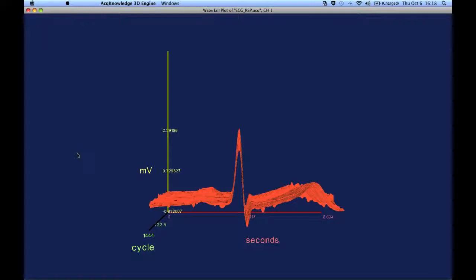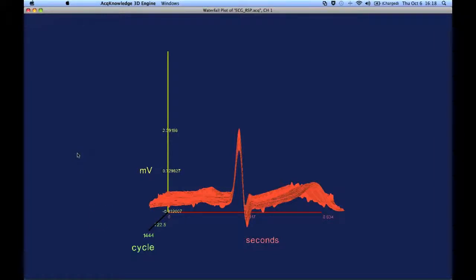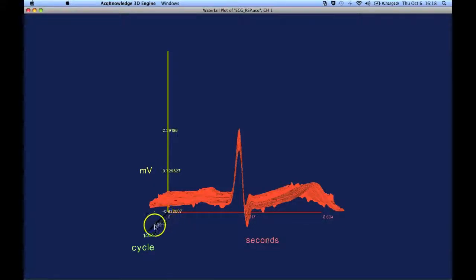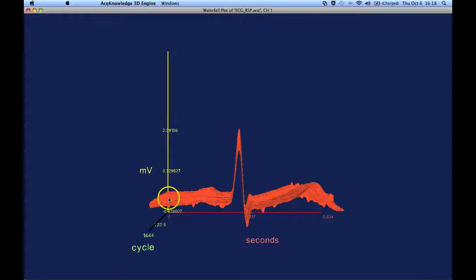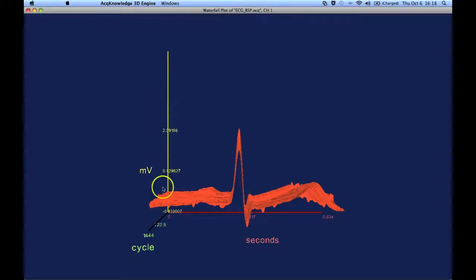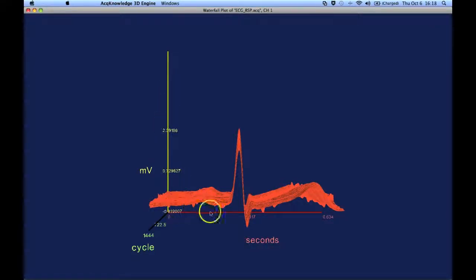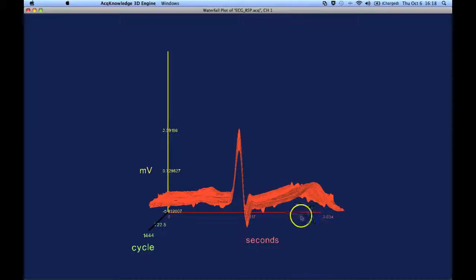This is a 3D representation, and you can see the cycle numbers coming forwards, it's 1,444, got the amplitude of the signal, and then the time window that was selected.